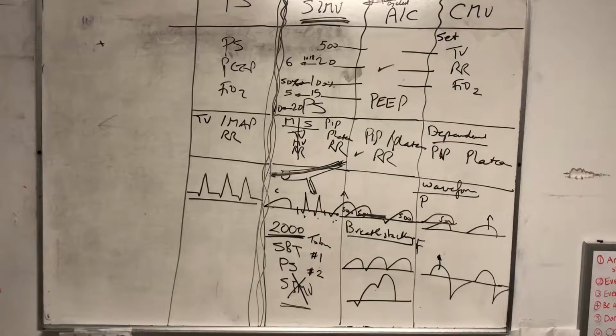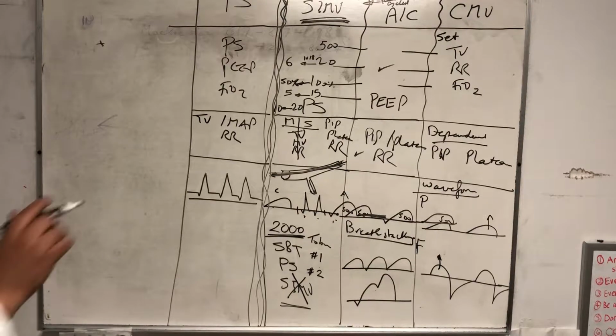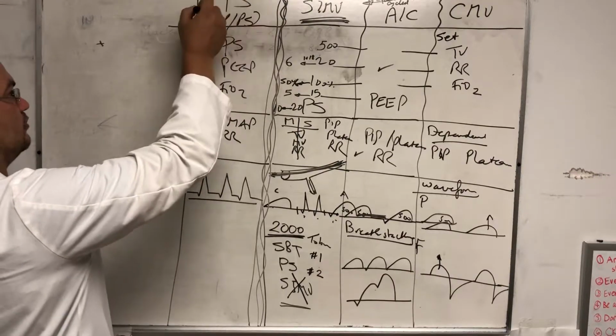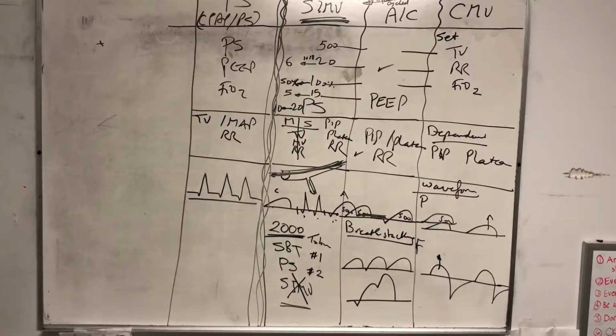So pressure support by itself is a misnomer. It's supposed to be called CPAP/pressure support. That's the mode, in fact, that we have in our vents here. It's called CPAP/pressure support. It's a long name. Some people call it CPAP. Can I put the patient on CPAP? Yeah, I know what you mean, right? Because nobody will put CPAP alone.